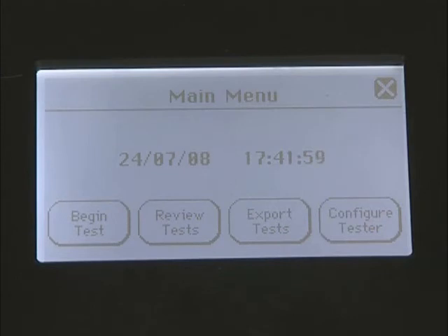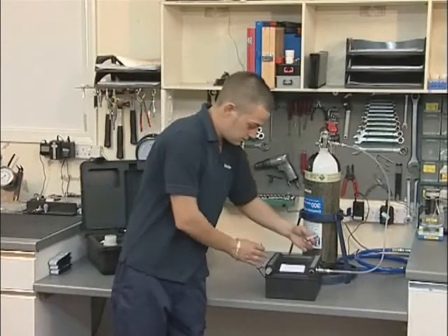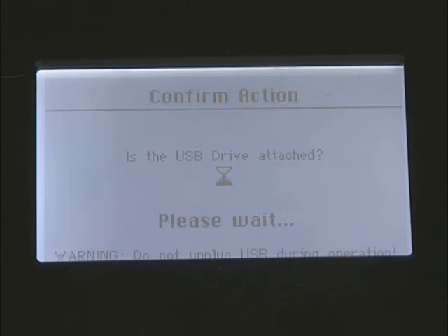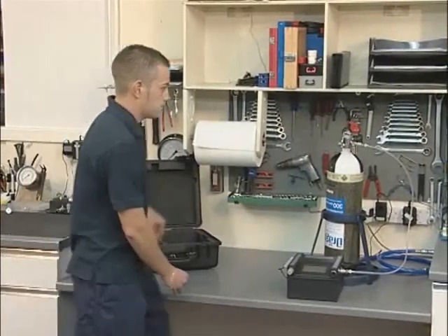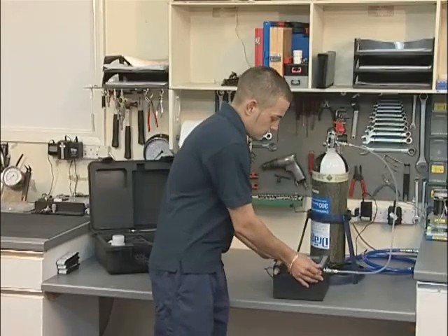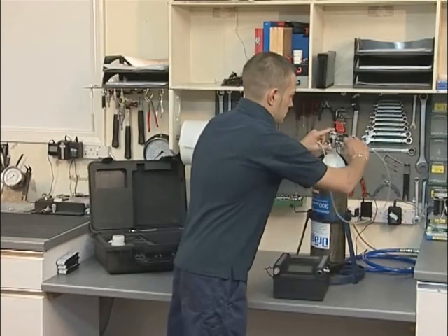To transfer test results from the SafeAir Tester to the PC software, return to the main menu and press the Export Tests button. Insert the memory stick provided with the unit into the USB slot and press Yes. Previous tests saved on the memory stick must be deleted before it can be used to export tests. Once the instrument has completed exporting the results to the memory stick, you can choose whether to delete the results from the SafeAir Tester's memory. To disconnect the tester from the cylinder, firstly turn off the cylinder valve, then depress the Odour Test button until all the air is exhausted. It is now safe to disconnect the connection hose and cylinder regulator.